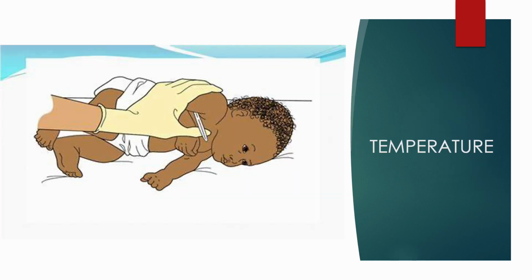To start with the procedure, let's assume that we are using the disposable thermometer. It is very important to start by checking the expiry date so that you may be able to get the correct readings. It is also very important to read the instructions of the thermometer that you have, which has not expired.